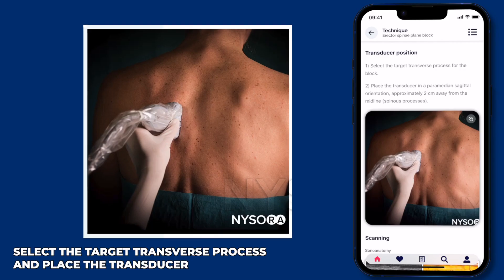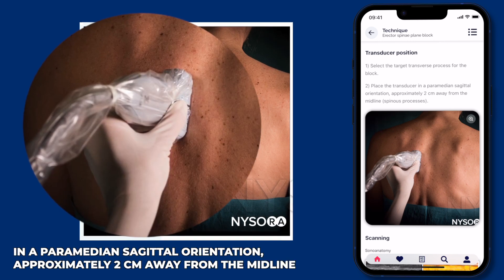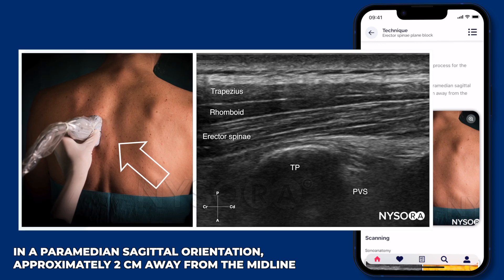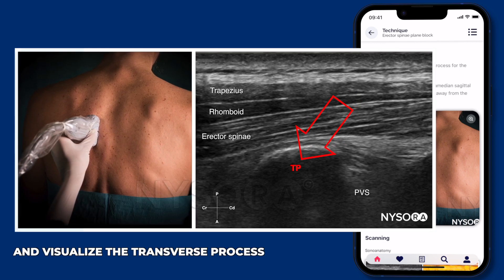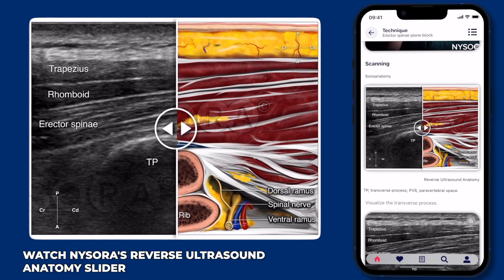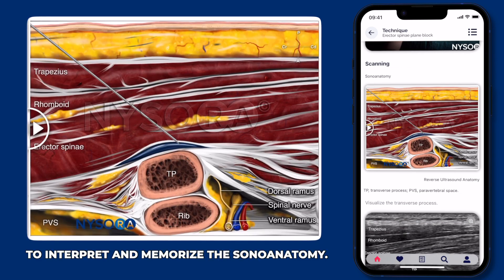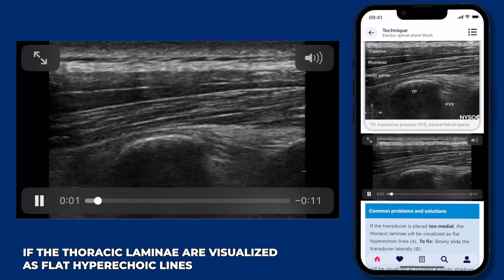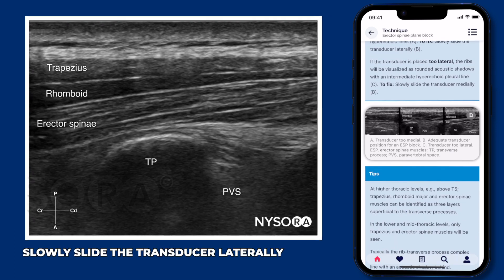Step one: select the target transverse process and place the transducer in a parmedian sagittal orientation, approximately 2 centimeters away from the midline, and visualize the transverse process. Watch Nysora's reverse ultrasound anatomy slider to interpret and memorize the sonoanatomy. If the thoracic laminae are visualized as flat hyperechoic lines, slowly slide the transducer laterally.